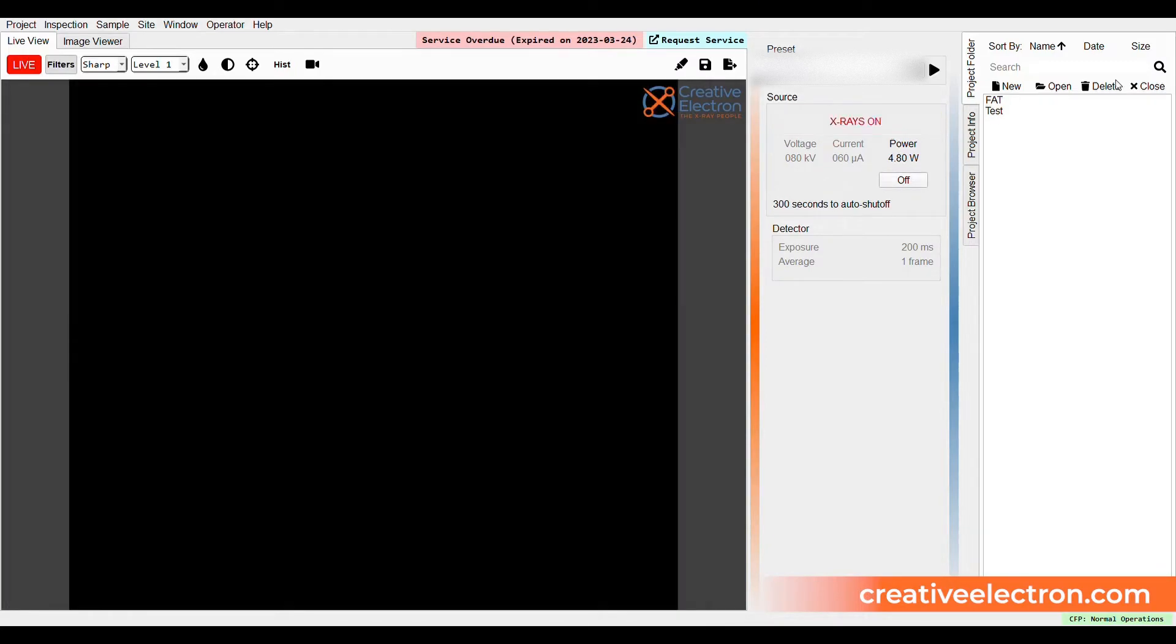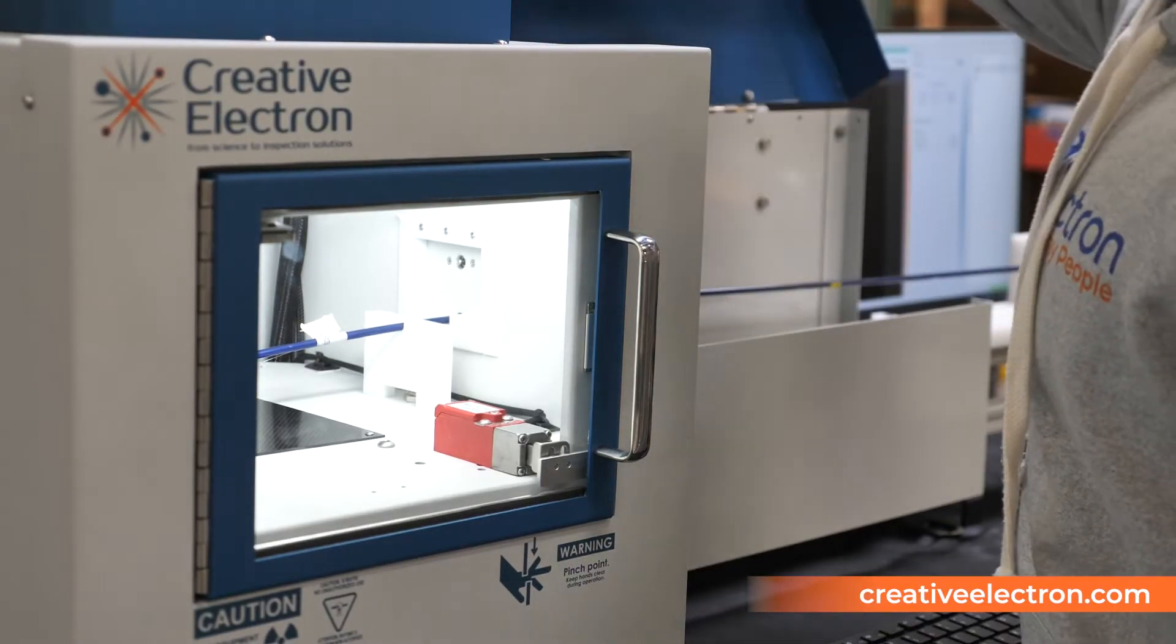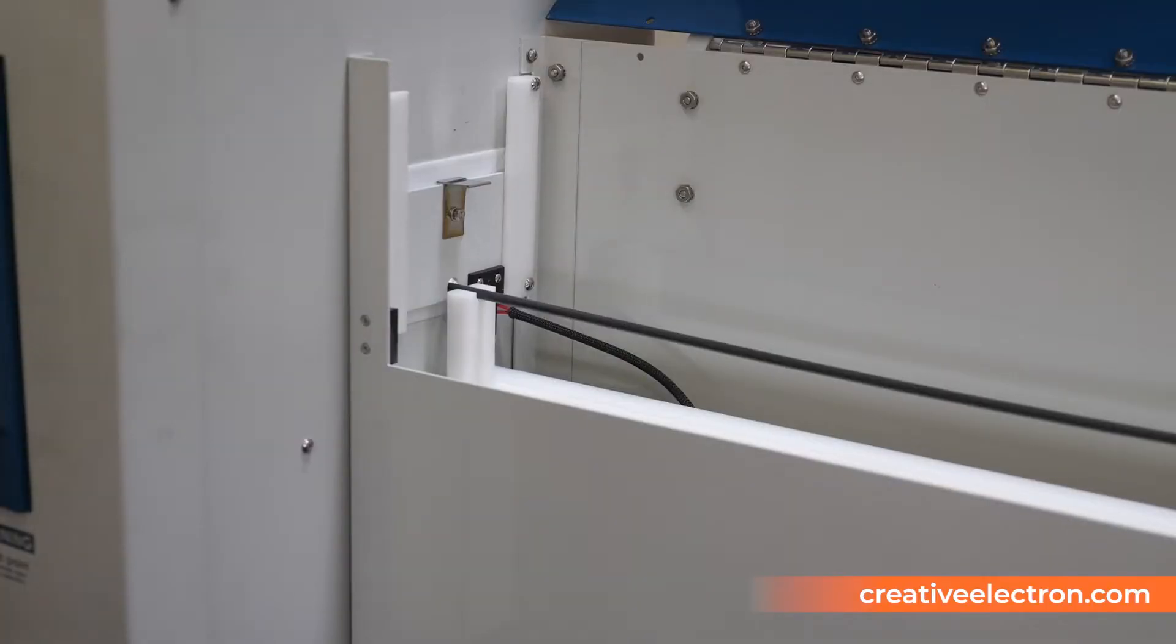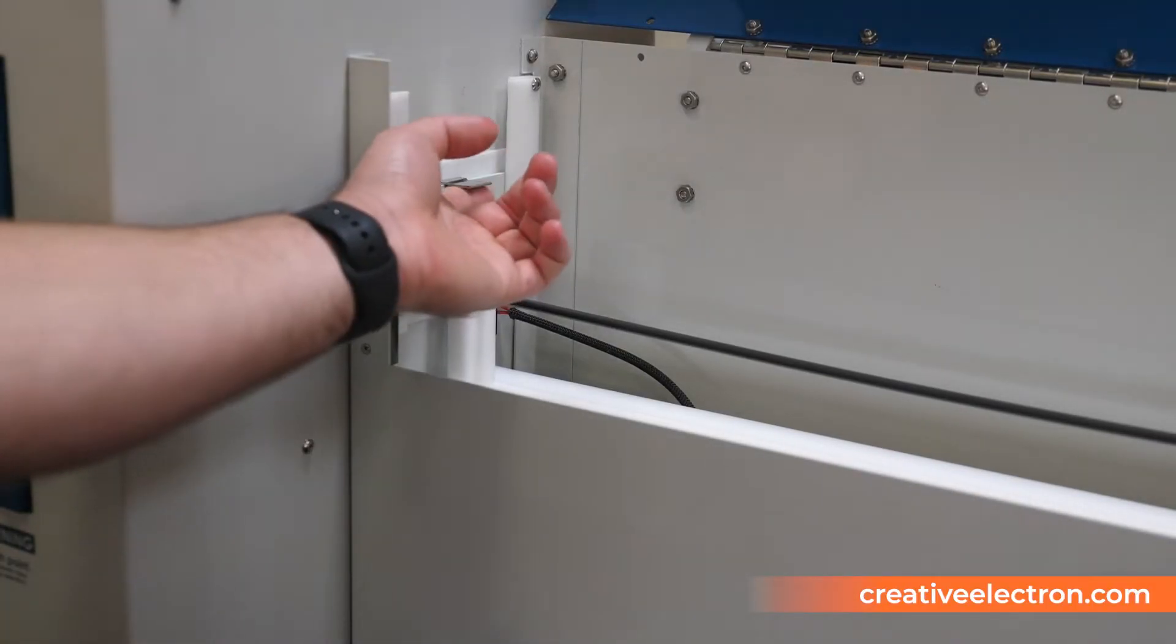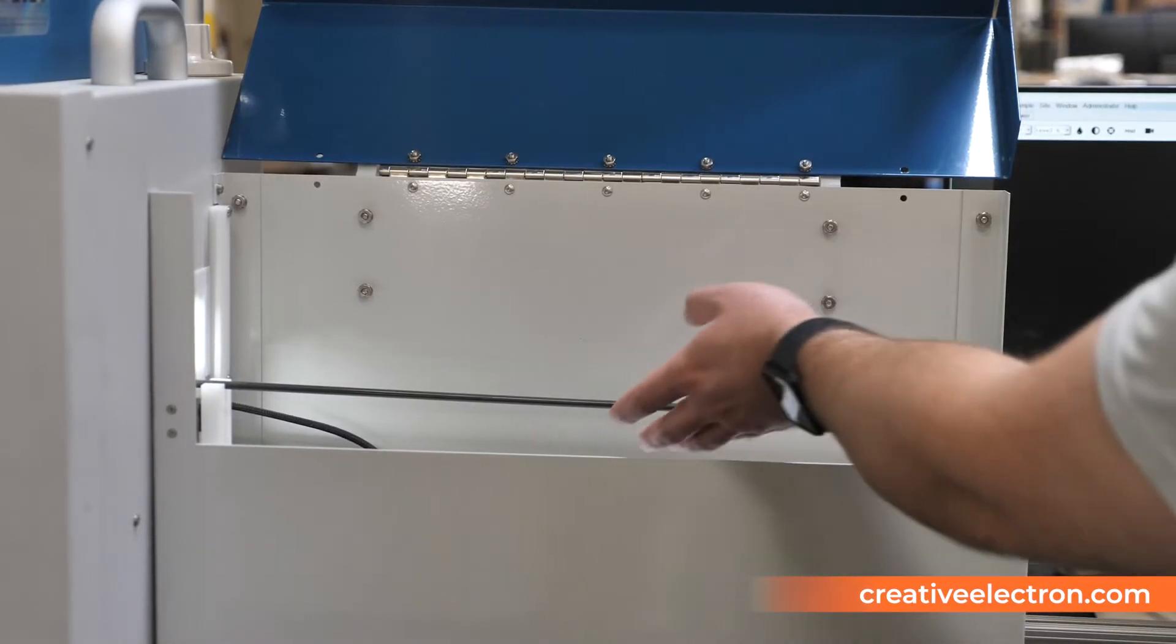After inspection is complete, removing the sample is as simple as opening the box cover, lifting the shutter door, and pulling the sample out of the side of the system.